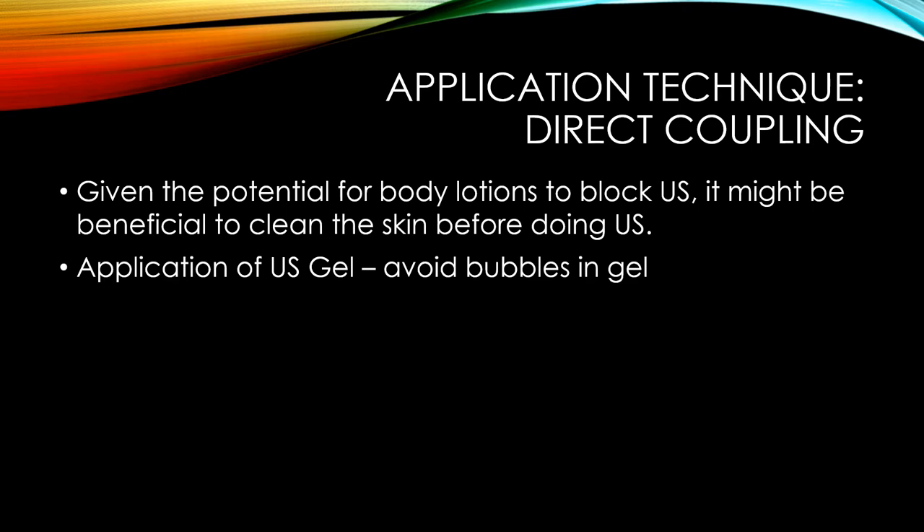When you use direct coupling and apply your ultrasound gel, you want to avoid getting bubbles in the gel because air will pretty much stop ultrasound transmission. Avoid squeezing the gel in a pile of spaghetti shape. Instead, squeeze it like a soft-serve ice cream pyramid so you don't get bubbles that limit your ultrasound transmission.